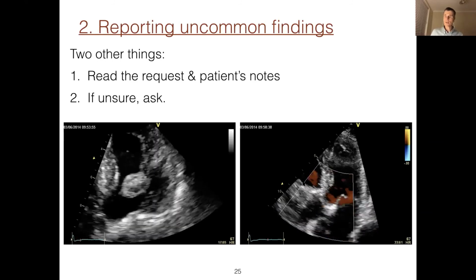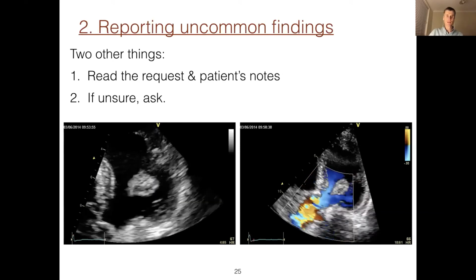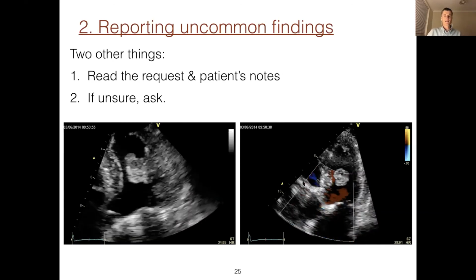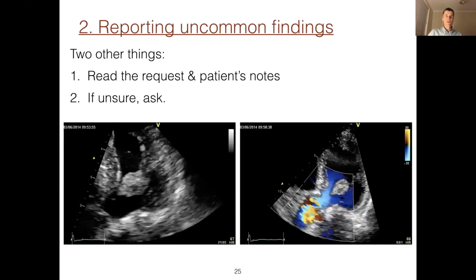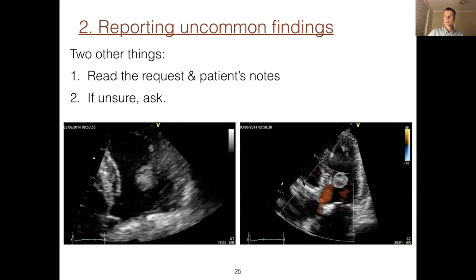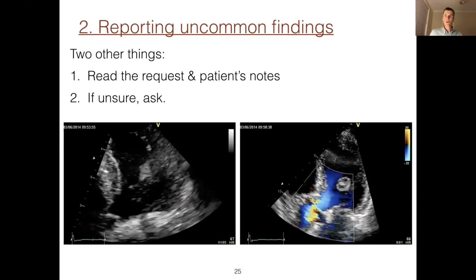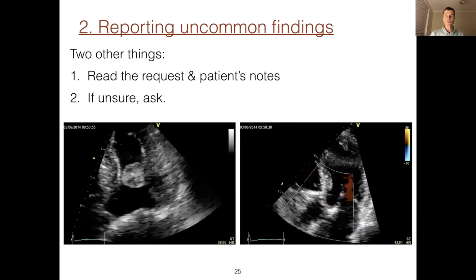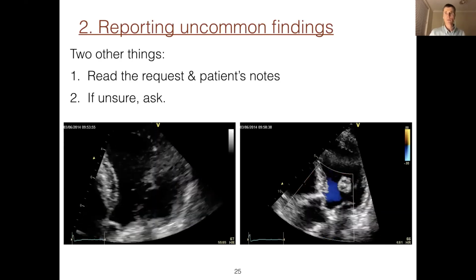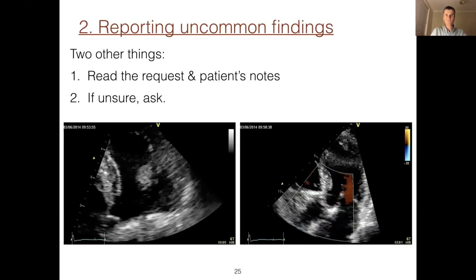What you want to be doing with any reports is making use of what people observed previously. So that's a key take-home message. If things are similar, cardiologists tend to like that. If they're not, that's when they get a little bit more concerned about things, and obviously when patients need to be concerned about things as well.